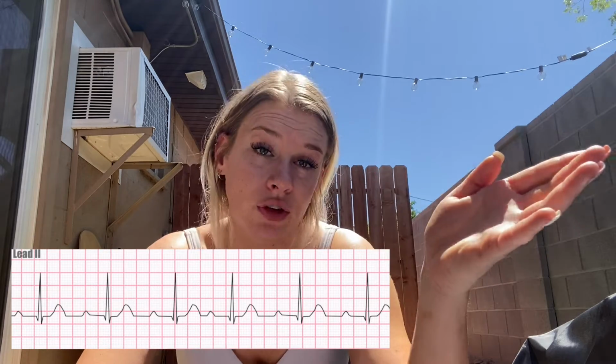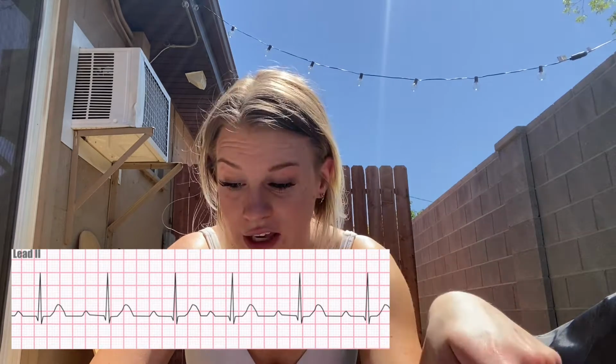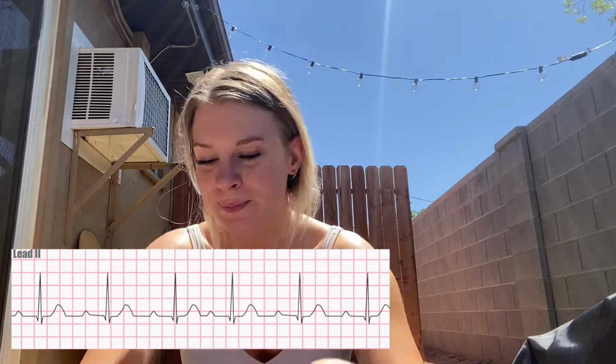So there's going to be a long PR interval, greater than 0.20, like the little squares, and all the intervals are going to be the same. The P's never drop a QRS, and the QRS is always going to be on time. And if the P's are on the T's, remember I mentioned that a little bit earlier, if the P waves are on the T waves and there's a fast rhythm, they are at risk for going into V Fib, and that's dangerous. We'll go over that too.